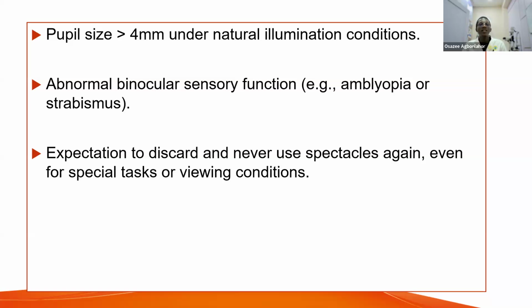So once in a while, you still fall back on your spectacles, so you don't throw them away, because there are times where you are contraindicated to wear contact lenses, especially in the presence of inflammation or some form of infection. You must stay away from your contact lenses. But for those patients that tell you, no, I don't want to wear glasses again, they are difficult to treat.